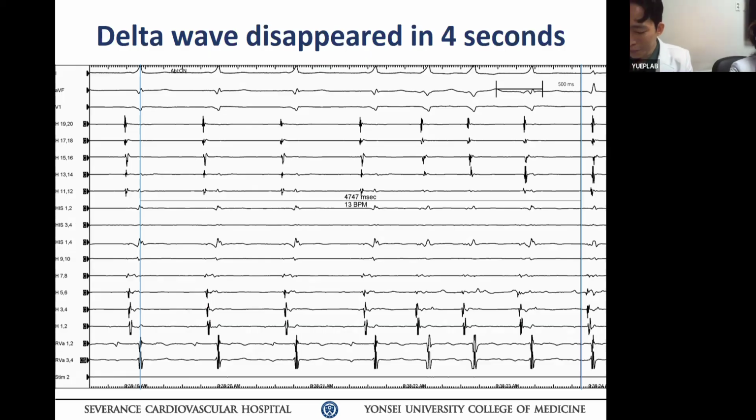So the delta wave disappeared within 4 seconds. This is during the burn. This is the start. This is during the burn, right?